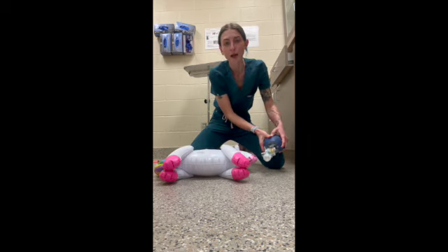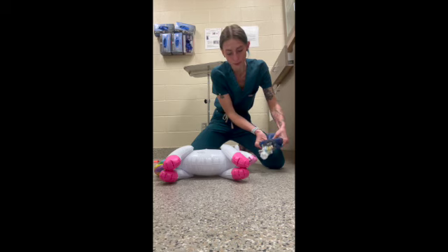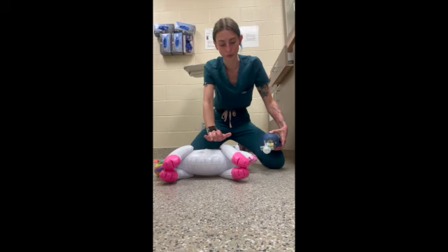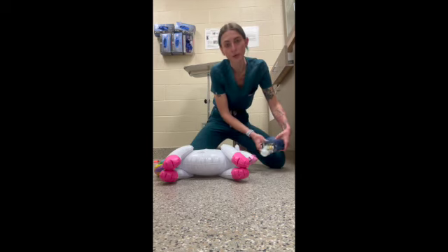And then for your breathing, once your patient is intubated, you're going to want to breathe with an ambu bag, and you want to give breaths that are pretty deep, because you want to be able to overcome that person giving the chest compressions. And when you're giving breaths, you want to give breaths about every 6 seconds or so.